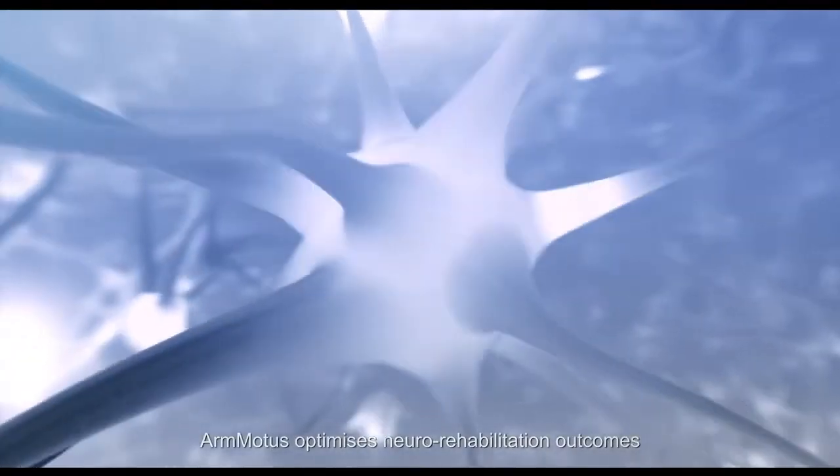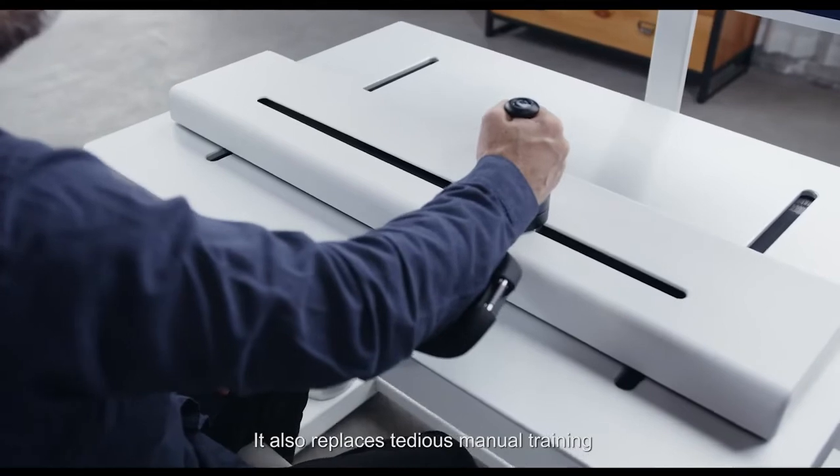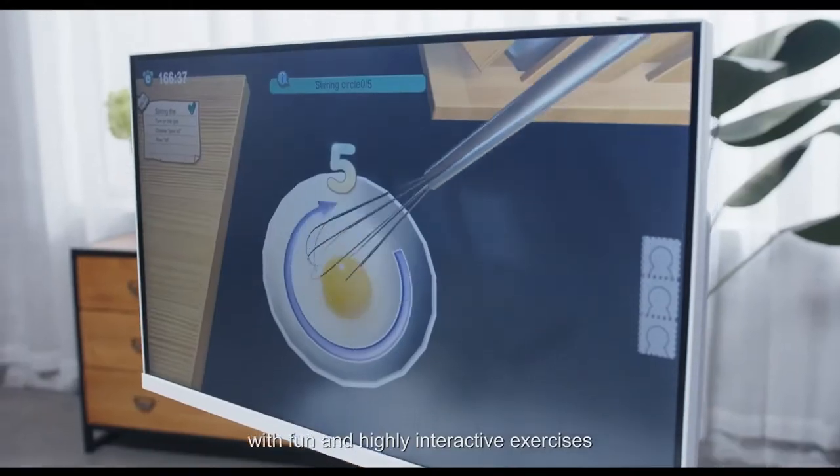ArmModus optimizes neuro rehabilitation outcomes via a more efficient training method. It also replaces tedious manual training with fun and highly interactive exercises.